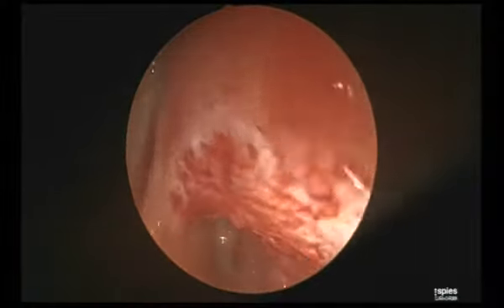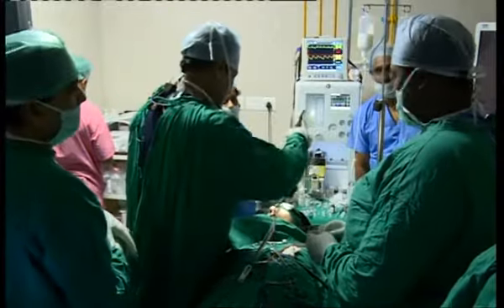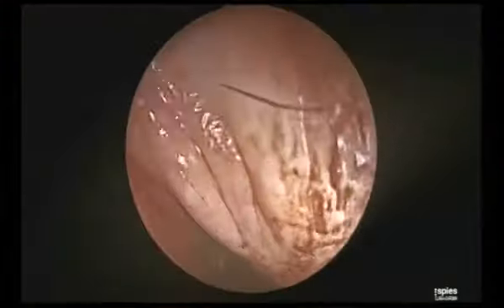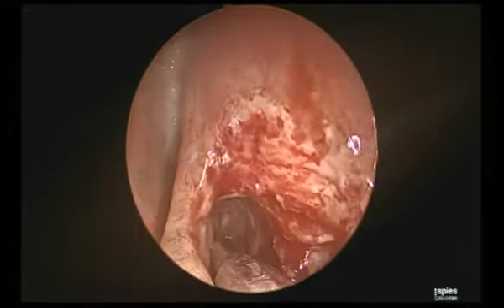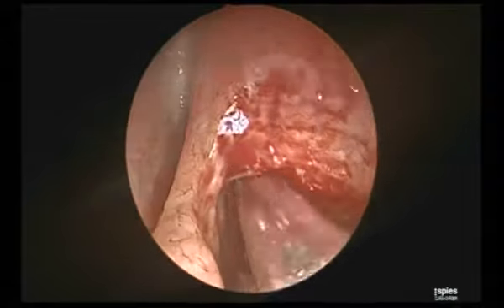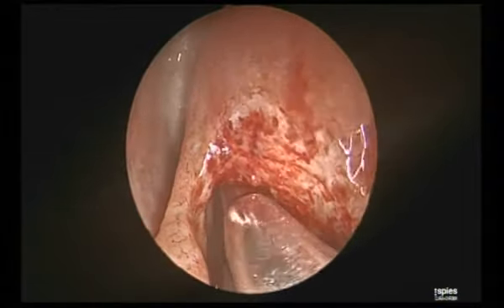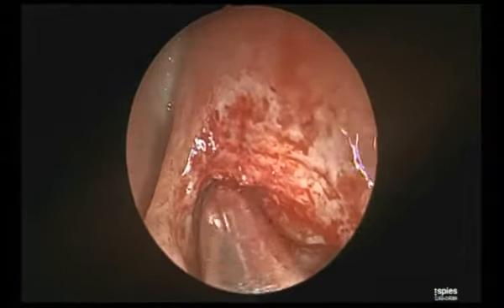Now, my most important limit, which I always respect as the most consistent landmark, is now going to come. Why is it coming later? Because I want to ensure my medial and lateral limit, and once you ensure your medial and lateral limit, work in between. Now, this is your beak, you see? So this is a 120? Yeah, this is 120 for working anterior.